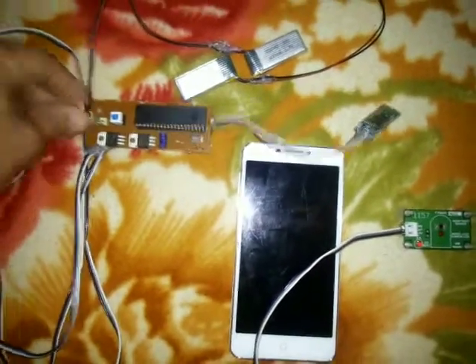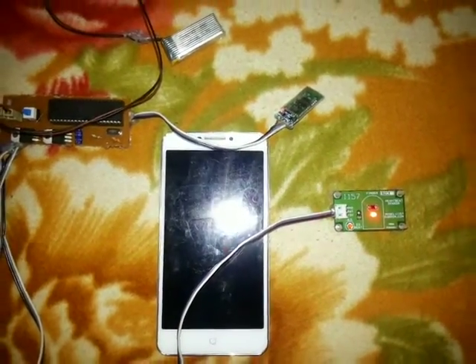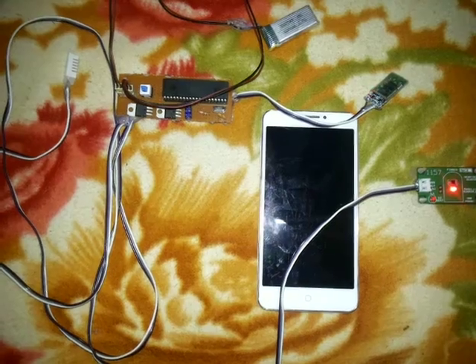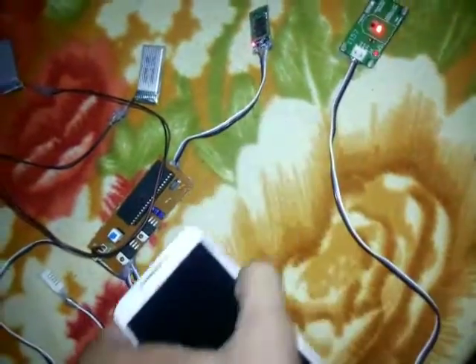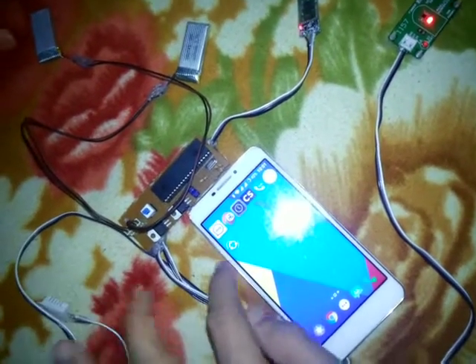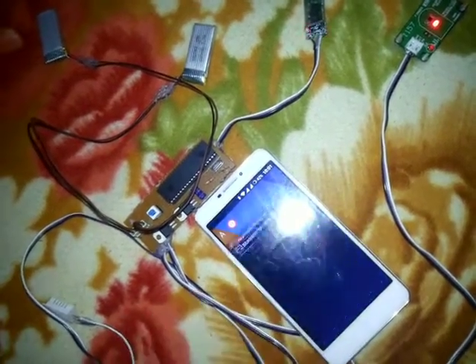We have connected two batteries to the system and we'll switch it on. The LED of the Bluetooth module is blinking, as well as the LED of the heart rate monitoring system is also on. Now we'll first try to connect the Bluetooth of the mobile to this system.